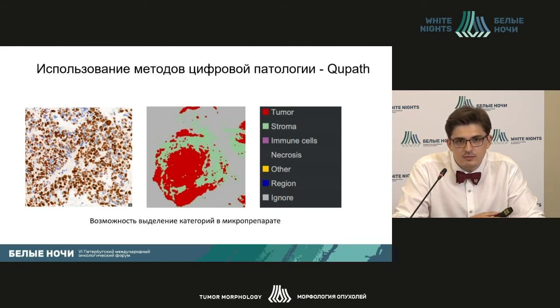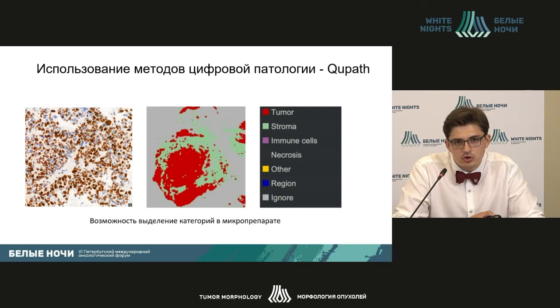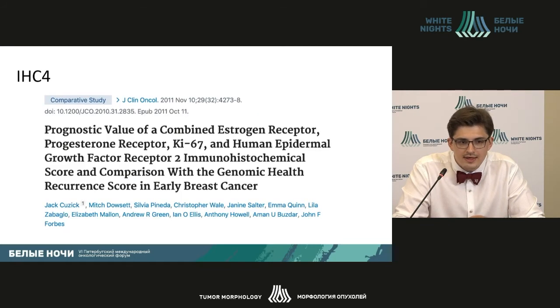QuPath enables us to standardize the process and obtain a quantitative assessment within the tumor, measuring the marker of interest in stroma, immune cells, and other compartments. We can mark tumor, stroma, and artifacts, then select and calculate. This can be done using the cell detection module, which can also be trained to improve accuracy.